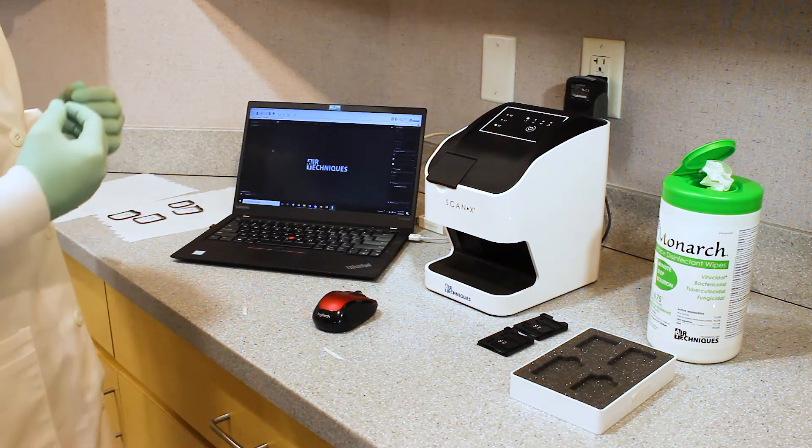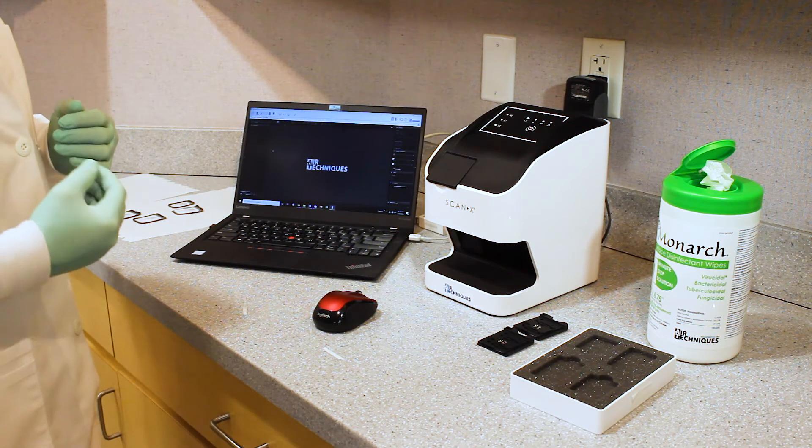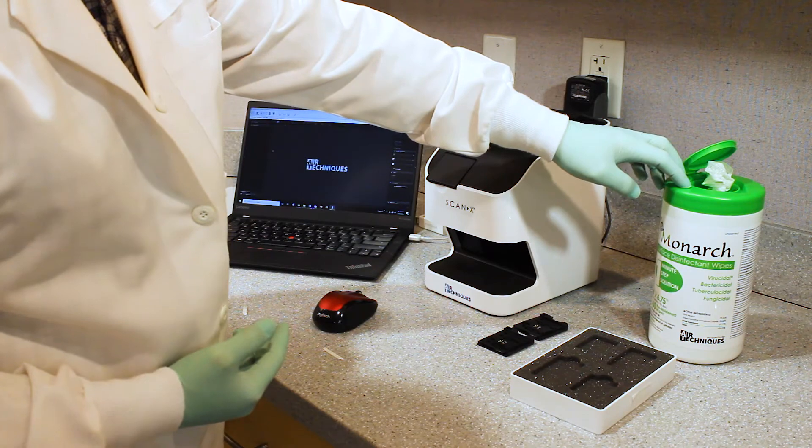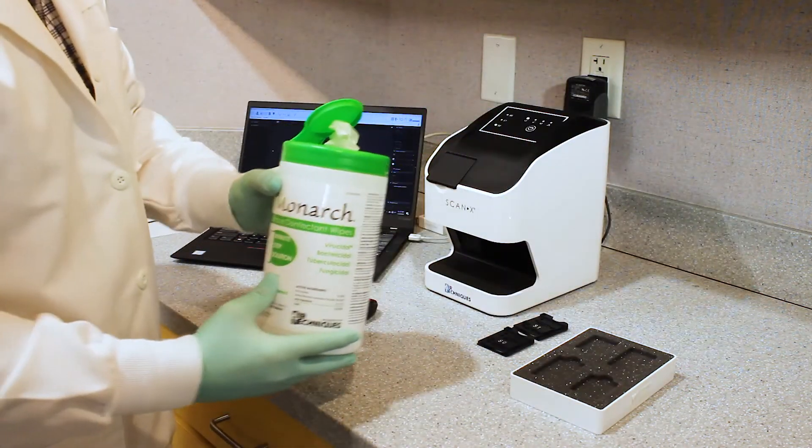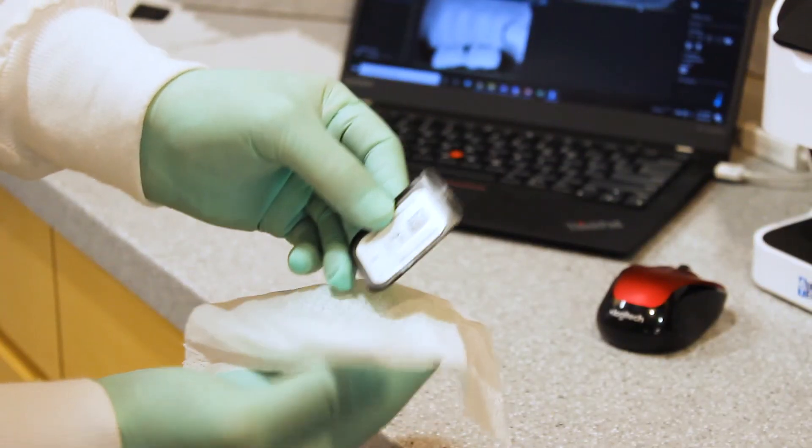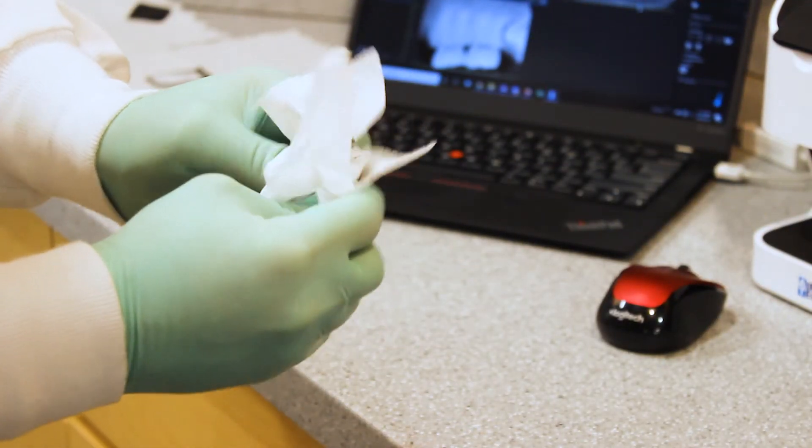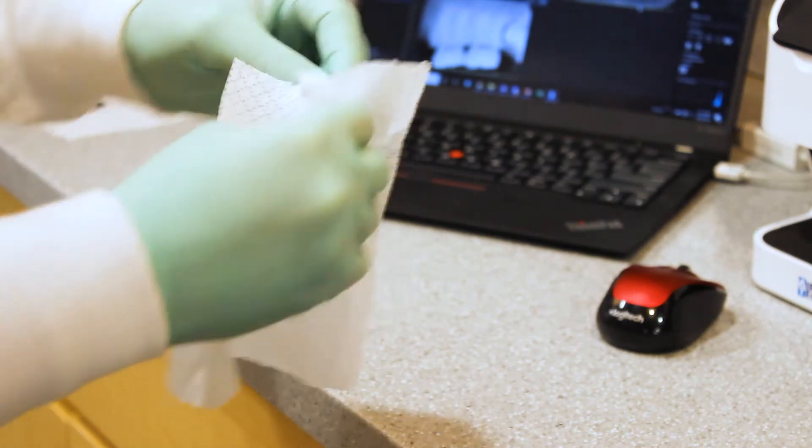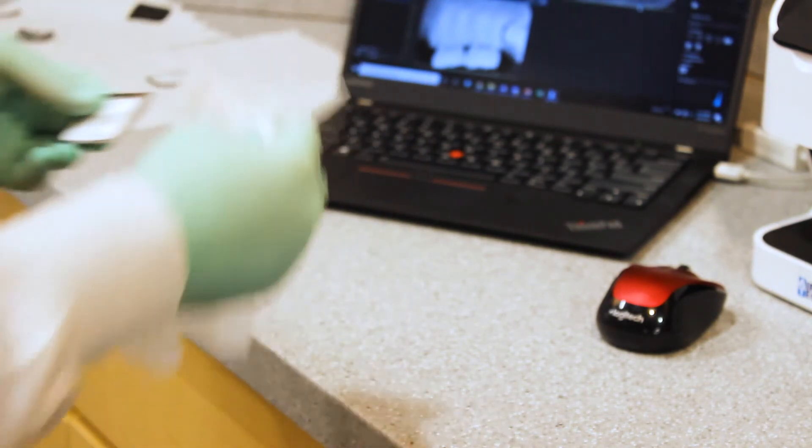Once we've done our exposures, we would then take the plates out of the patient's mouth. We would use a disinfectant wipe, such as Monarch, as we have over here. And I will follow the instructions of the wipe to wipe down the plate in the used barrier envelope.